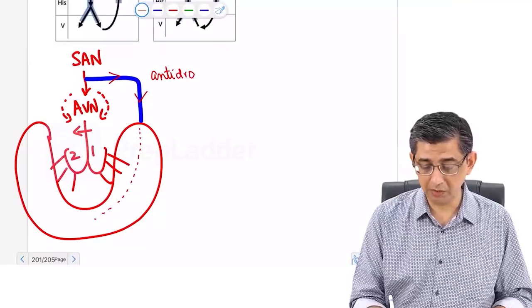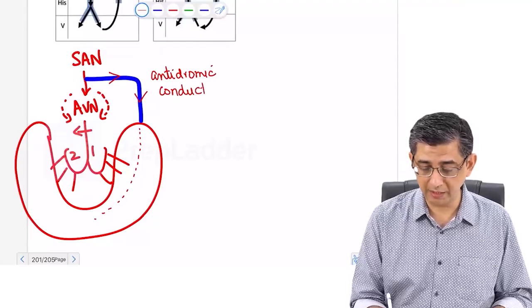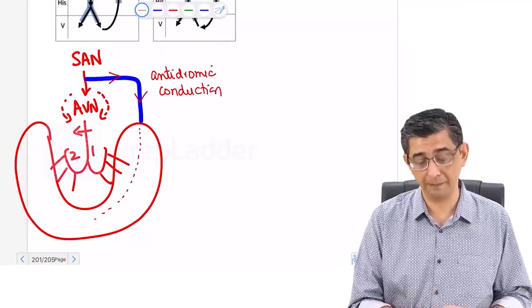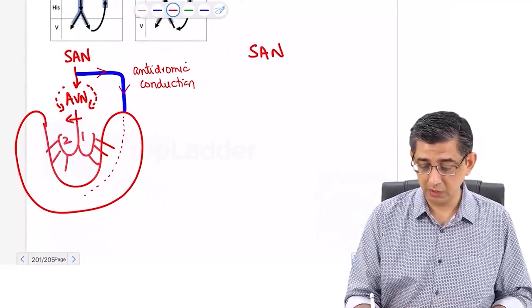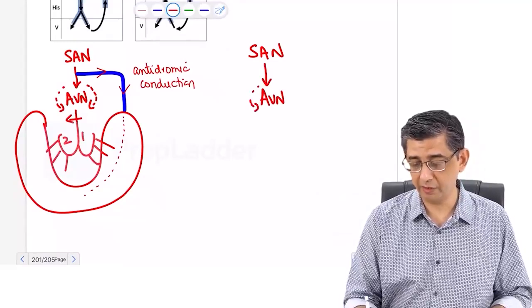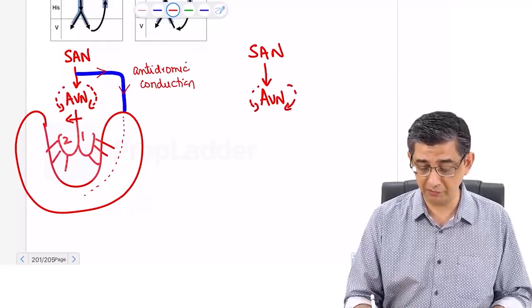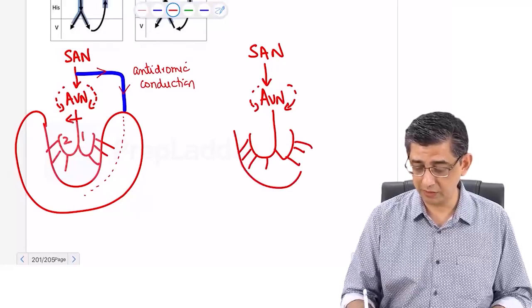Well, how do you remember this word antidromic? You can just go by the alphabet A. It is antegrade conduction which is occurring across. Now compare this with the line diagram once again. So you need to compare the second diagram that I make before you. At the moment, everything is still the same, but there will be a minor difference which I would like you to pick up, and that will be the key point of this particular discussion.